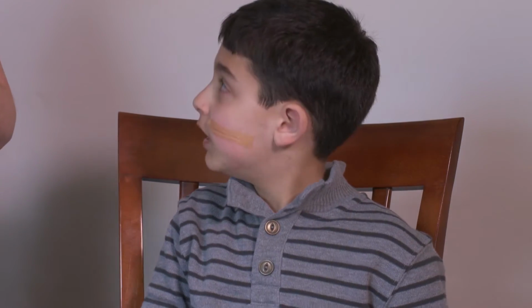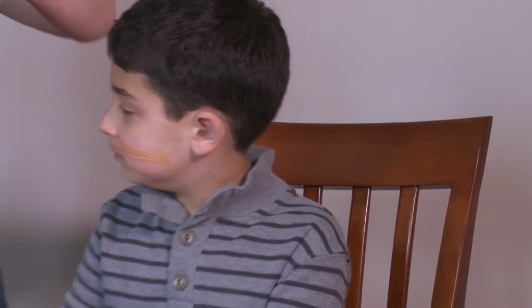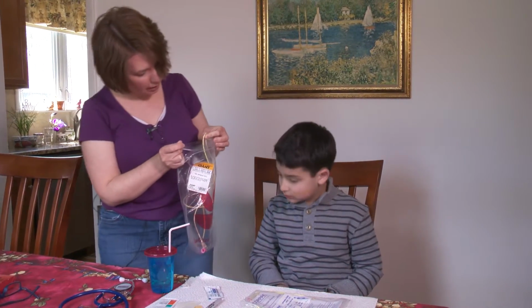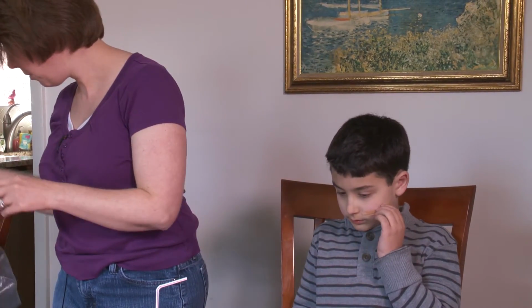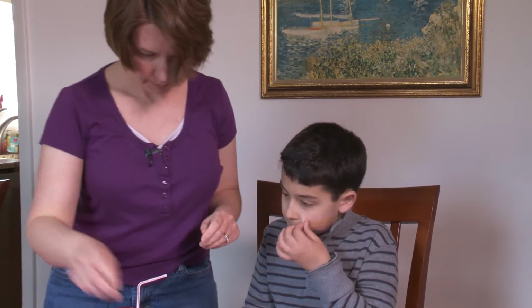And any tips about how to make that easy? Just pull it out fast so it doesn't last long. Just the faster you get it out, the better. Now, I also always kind of double check that I'm right about how far I had the tube in last time. So last time I had it in 51 centimeters. And also you want to take this off. Yep, you're going to take that off. Go ahead.